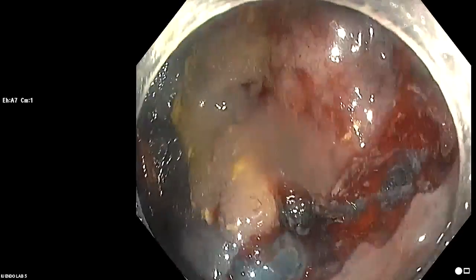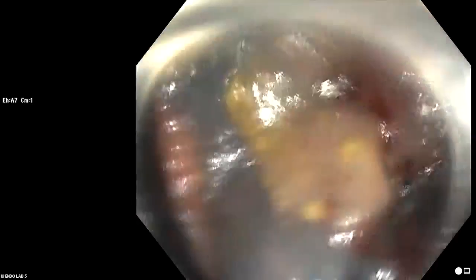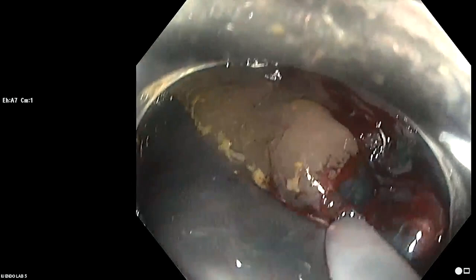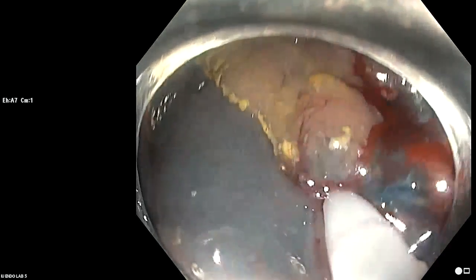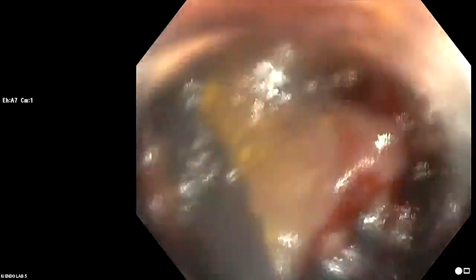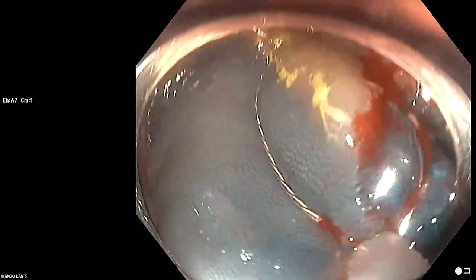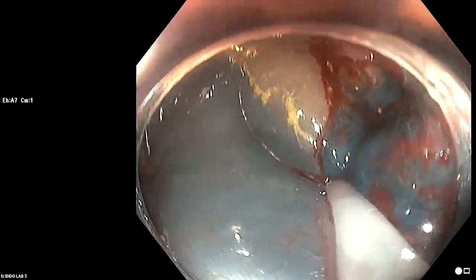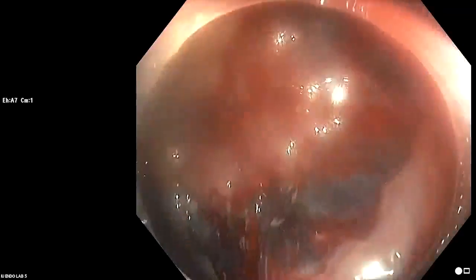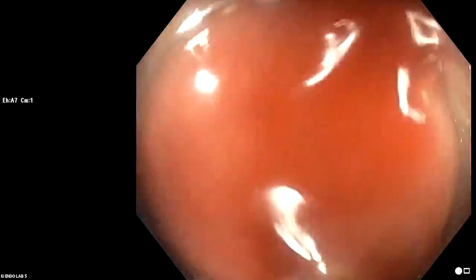Do you feel any little bit of fibrosis there? John said he thought he could feel a little bit of hang up right there as we get to the middle of this, open. I will occasionally, close, have fibrosis be something that will get me to convert to electric cautery for a serrated lesion. Now, I was saying that we don't clip these because we're removing them cold. But I don't know if you saw, close and cut, the retrospective analysis of Heiko Pohl's study that was recently published in CGH, which showed that clipping did not benefit.